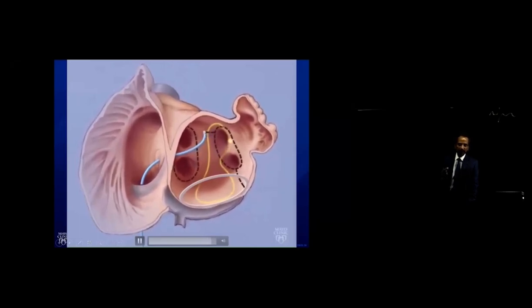That's why we have to pair entrainment with a map of the flutter. Are we able to also entrain at other sites along the mitral isthmus, mitral valve? If not, it could be one site that's near the mitral valve. Others are complex, going through gaps in a roof line, posterior line, or in the pulmonary vein circles. In a way, even though this is a complex flutter, it does give us multiple ways to solve the problem.